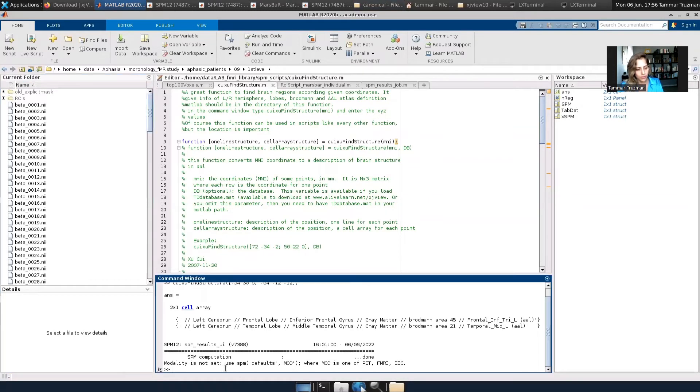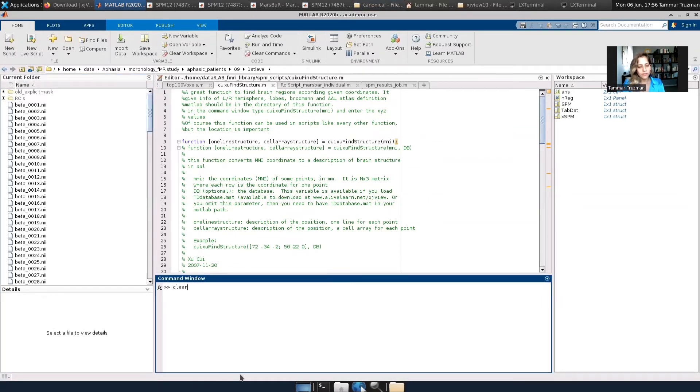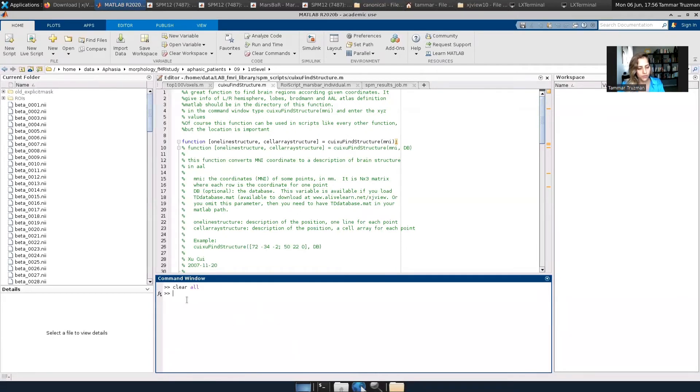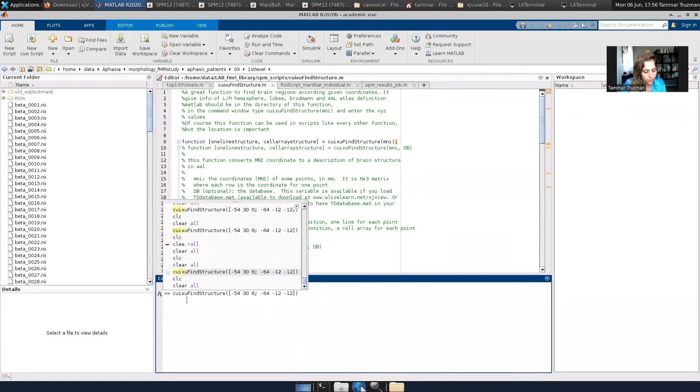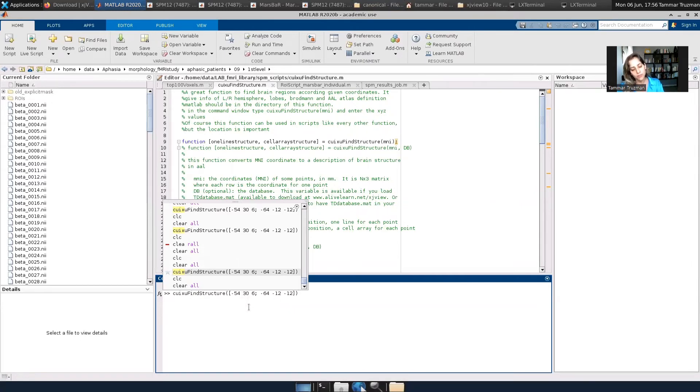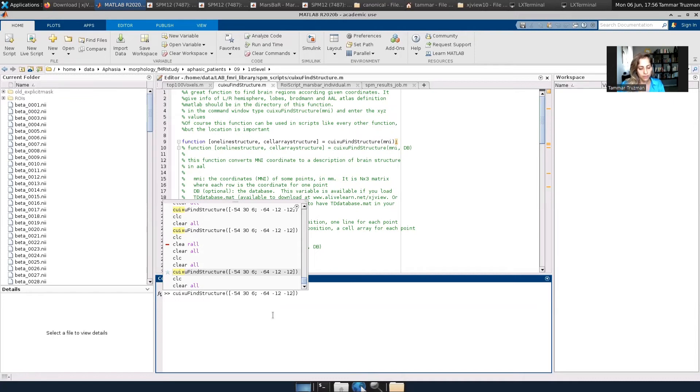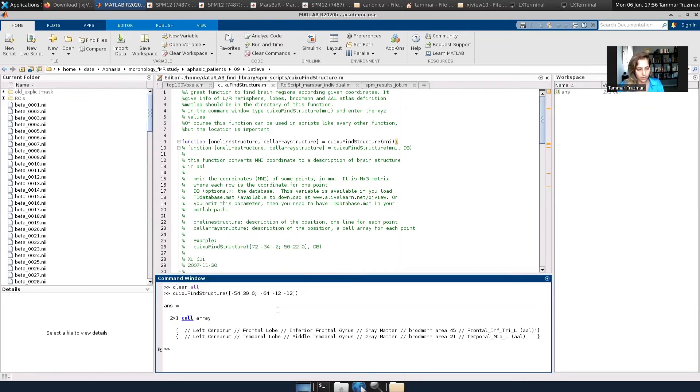So let me just give an example. The function is called... find, here, yes. So I just took two coordinates, temporal gyrus and I think frontal, and let's find out what information we get.